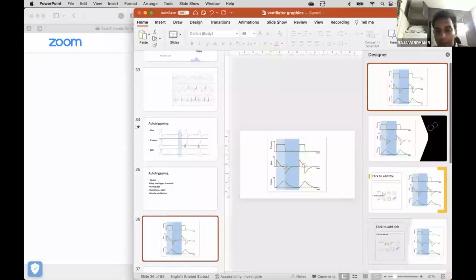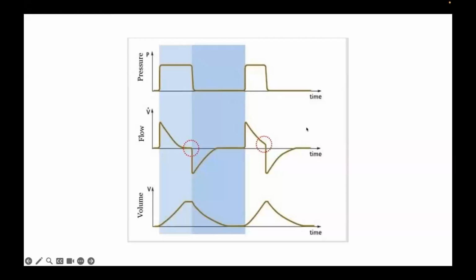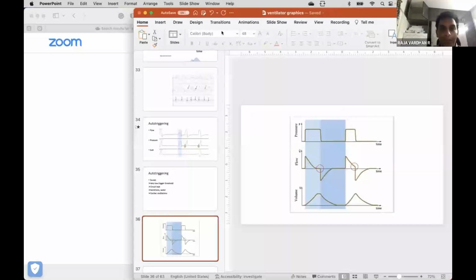You're able to see the PowerPoint? Yes. This was asked in the IDCCM exams recently. Can you tell me what these two modes are? The first one is pressure controlled. Yes. The second one is pressure support. Yes, that's it, perfect. It was asked in the exam recently, so I thought you people should be aware. That's it from my side. Thank you.